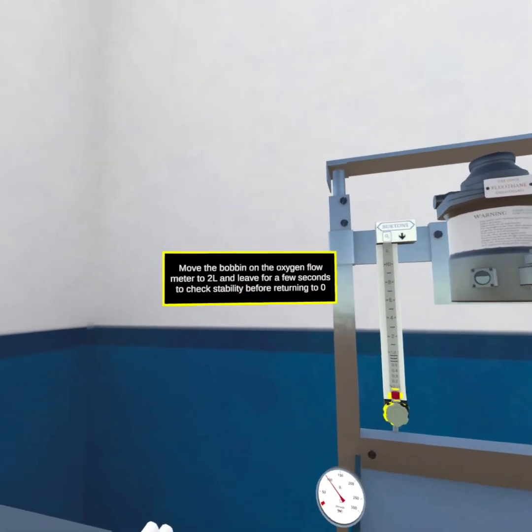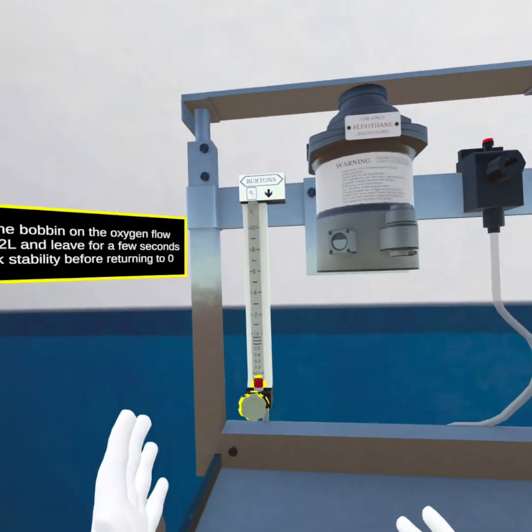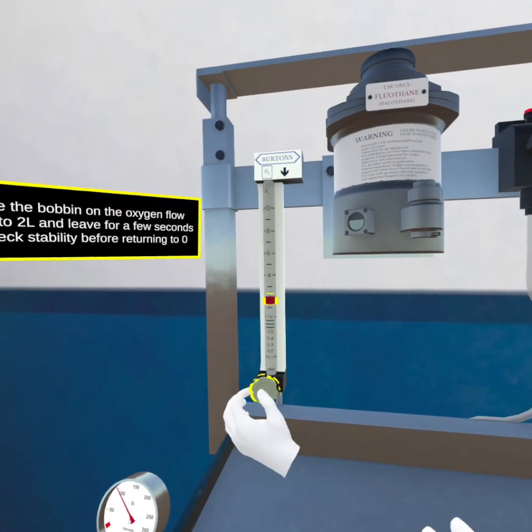Move the bobbin on the oxygen flow meter to 2 litres and leave for a few seconds to check stability, before returning it to zero.